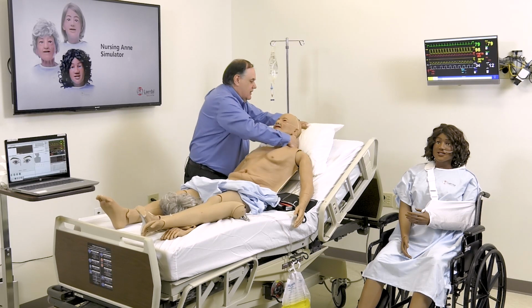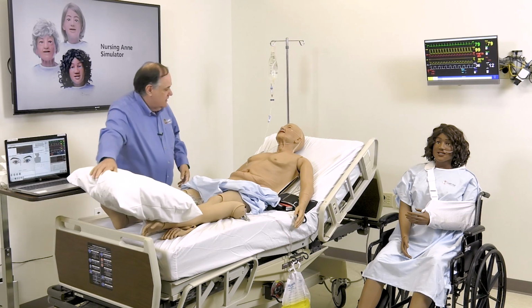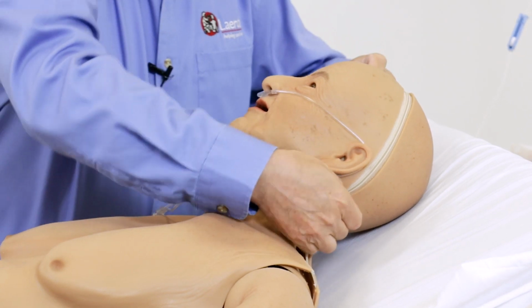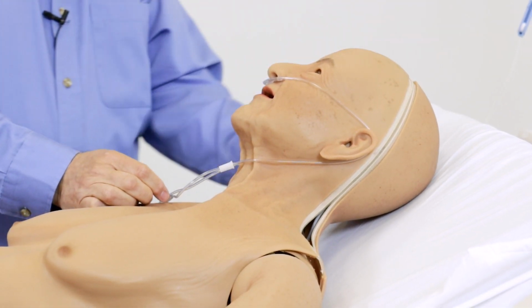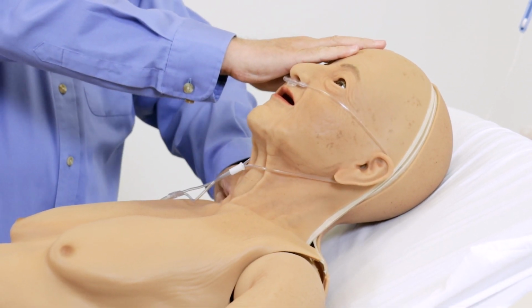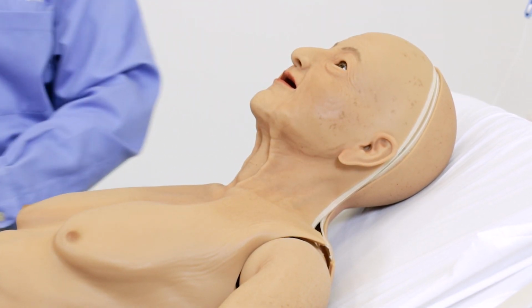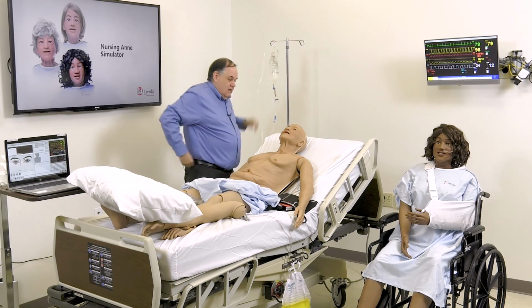And again, just going to gently remove our pillow. The pillow down here. And I'm just going to unzip. So again, there's another zipper that goes around. It goes all around her head and down her other side of her neck and on her shoulder. She no longer needs her nasal cannula, I would imagine, since we're taking her skin off. So we'll hang that up out of the way.